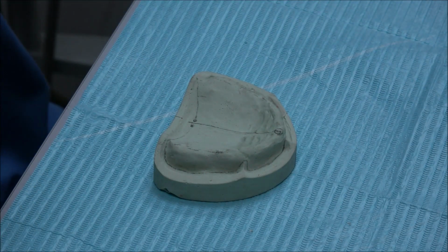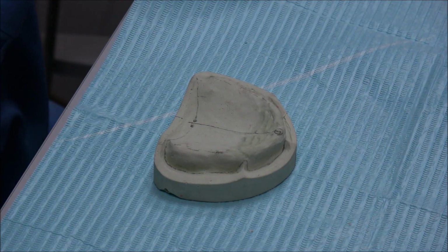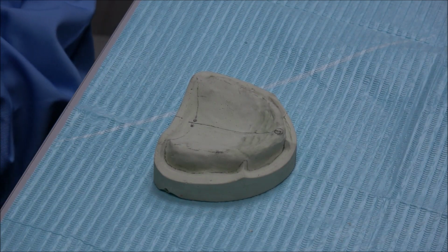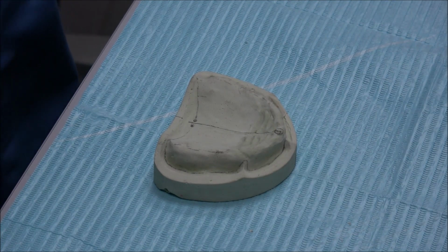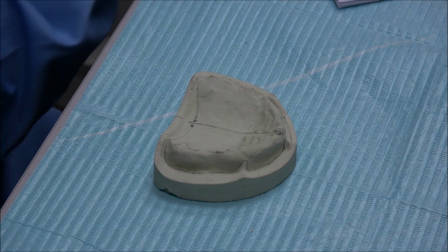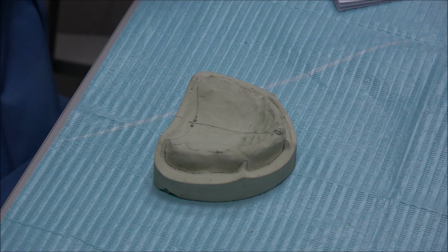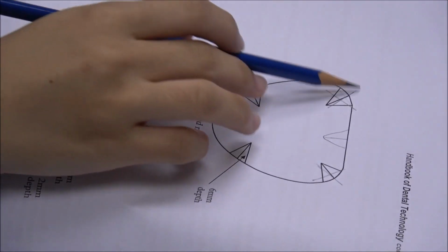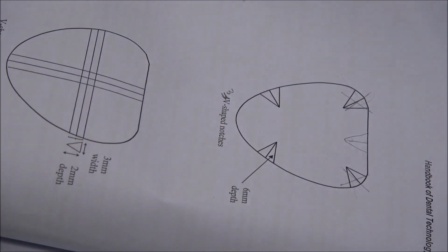Everyone, please turn to page 60, figure 14. Can you see? The first image has 4 V-shaped notches here. So there is a correction here. We do not do 4 V-shapes. We correct to 3 V-shapes. We change to 3 V-shapes, and then it will be like this. Can you see? So we cancel these two, and then we make it in the middle. 3 is enough. Okay.